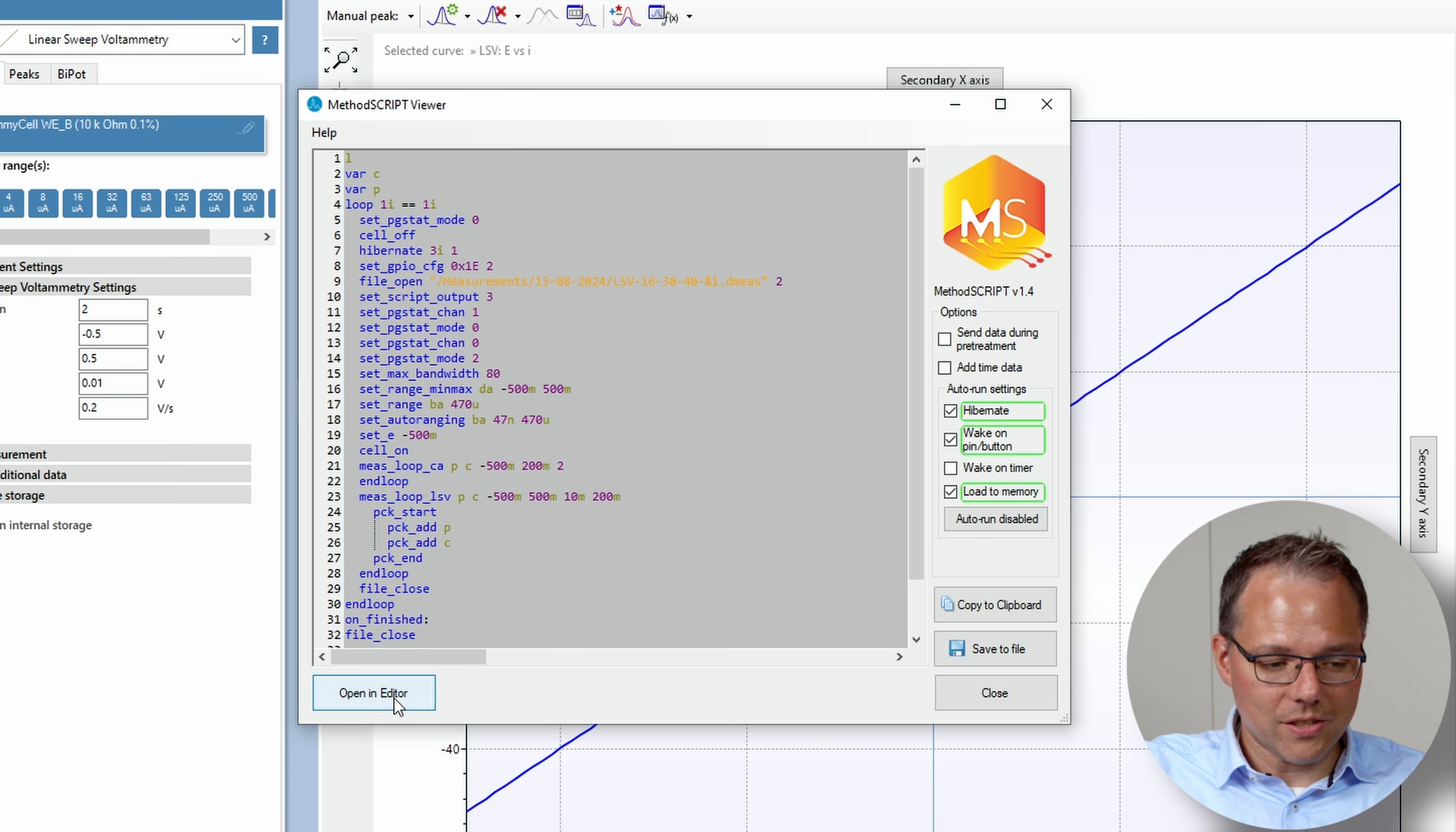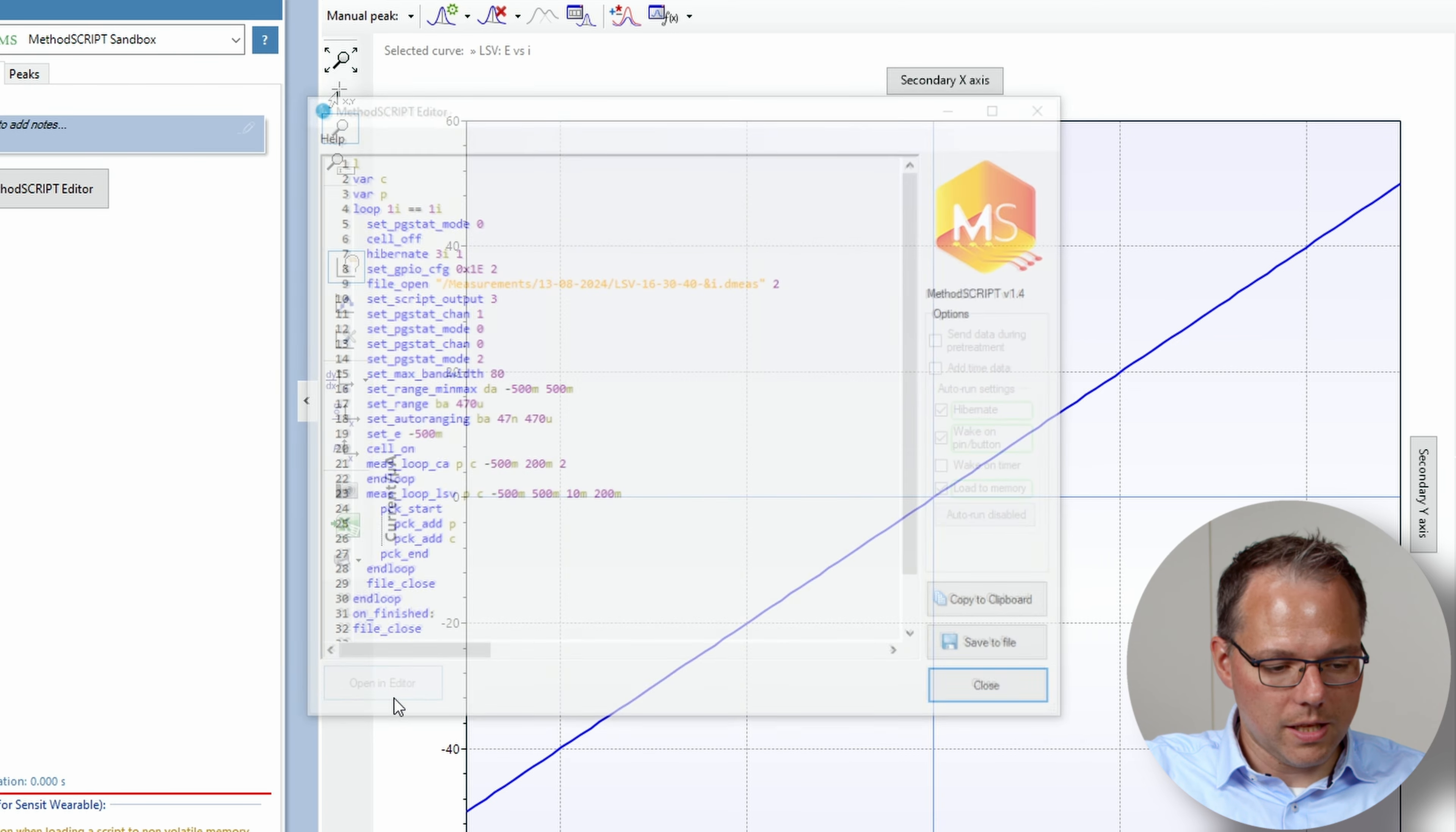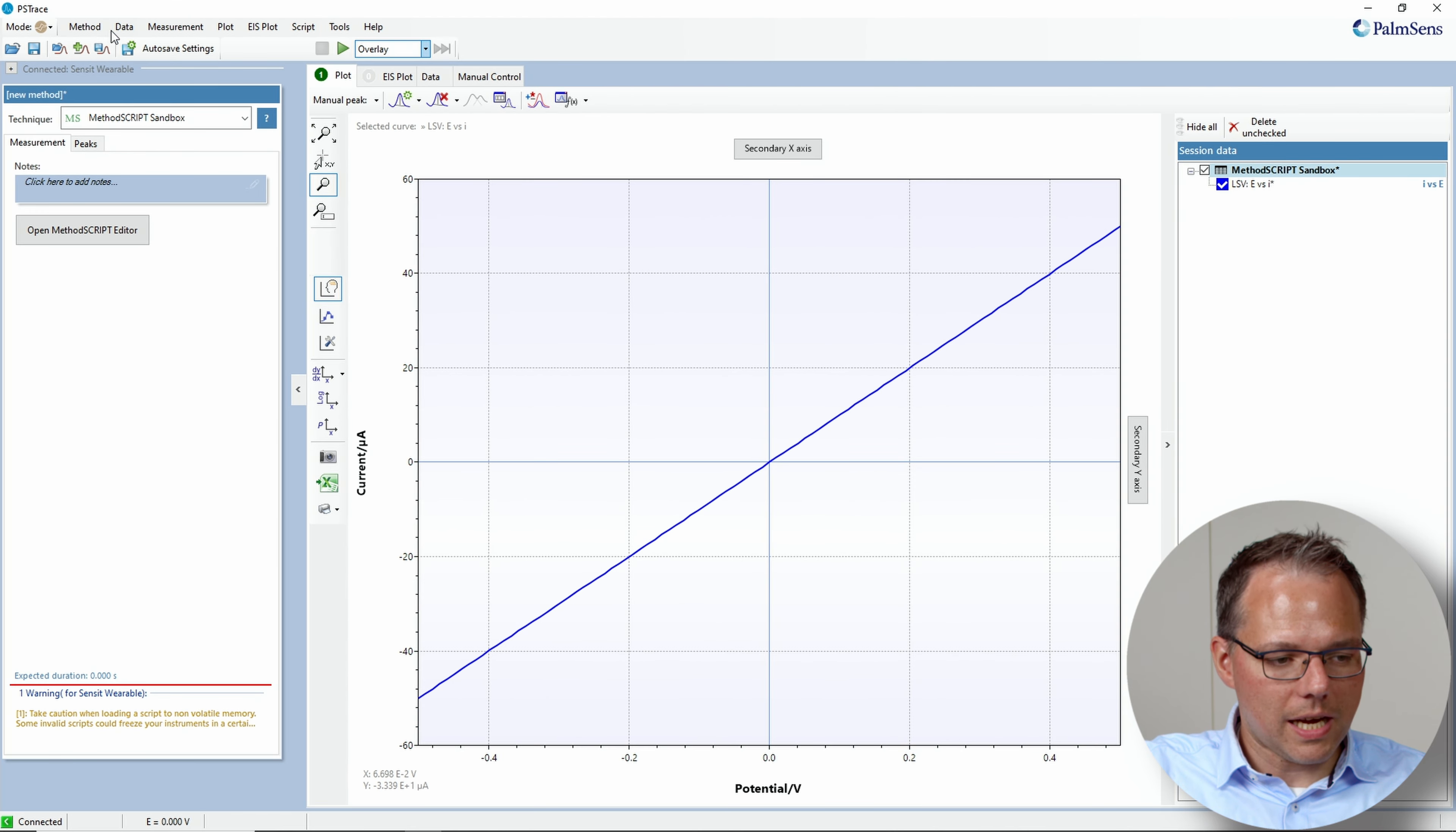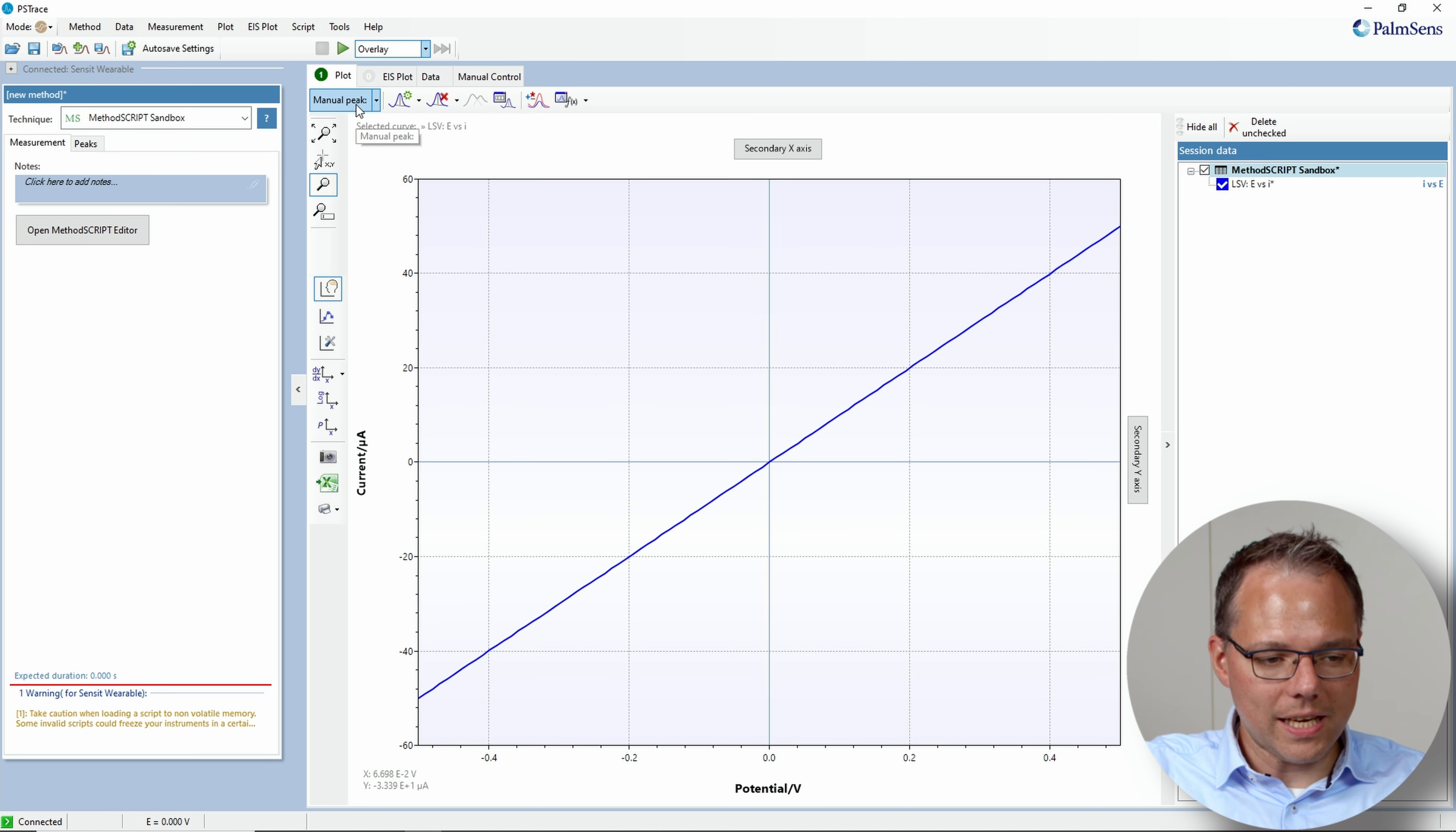First we have again to open the script in the editor, then we close it, and we have the method script sandbox again available.